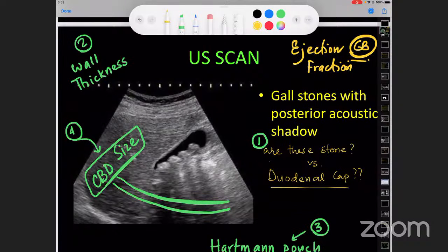We compare the pre-butter gallbladder volume and the post volume, and if the gallbladder has contracted significantly, then it is functioning normally. In the last 5 years I have done 2 or 3 cases, 1 or 2 of which probably Sarah sent me. So that is the whole idea.